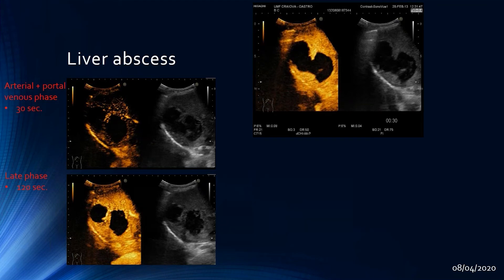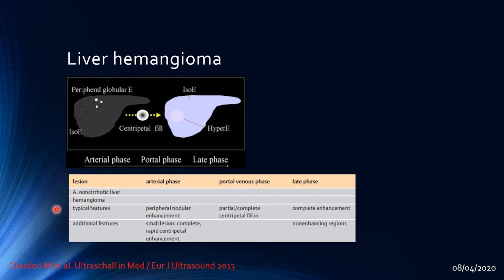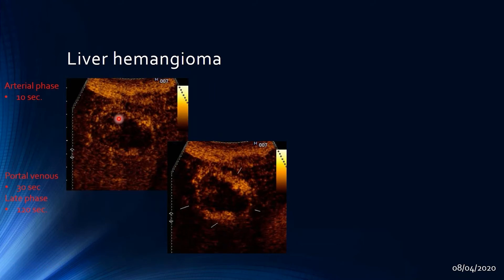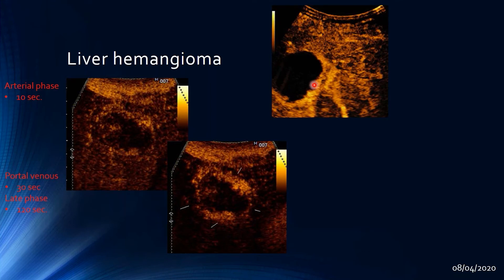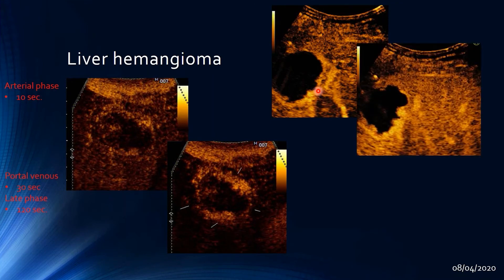Liver hemangiomas have a typical appearance: peripheral nodular enhancement in the arterial phase with rapid centripetal fill-in for small lesions, and complete centripetal fill-in during the portal and late phases — sometimes with non-enhancing regions. The example shows peripheral centripetal enhancement gradually filling in towards the center in a nodular, budding pattern until the lesion is completely filled.